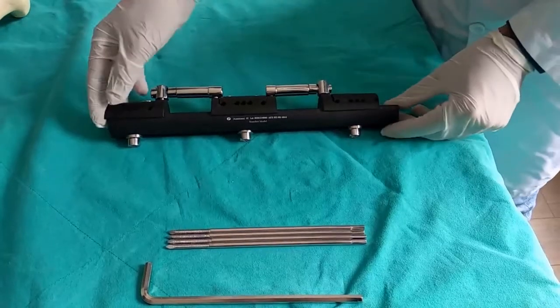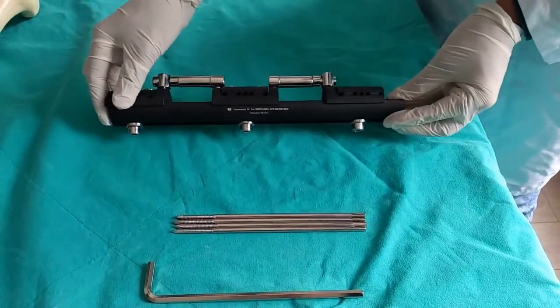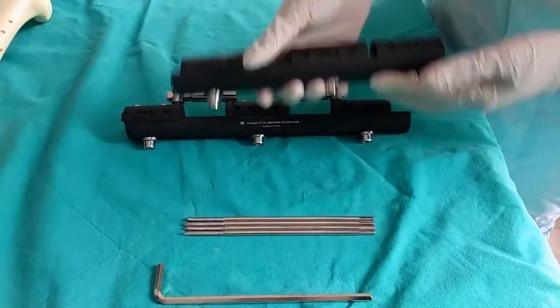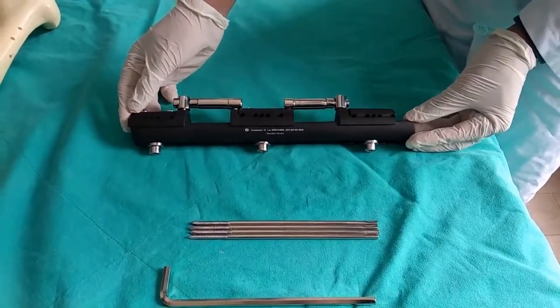This is Anatomy's Limb Lengthening External Fixator. The package comes with an Allen key, four chassis screws, and a fixator. We have three sizes: small, medium, and large. We'll show you a surgical technique for the medium size here.